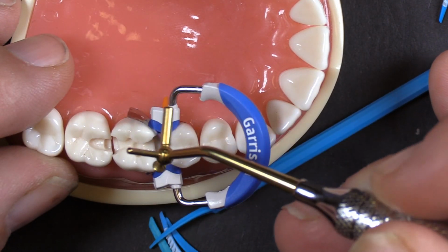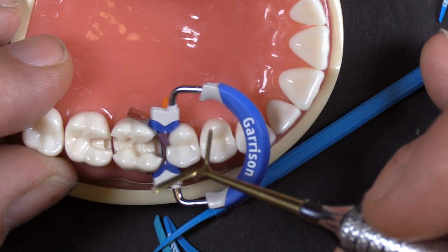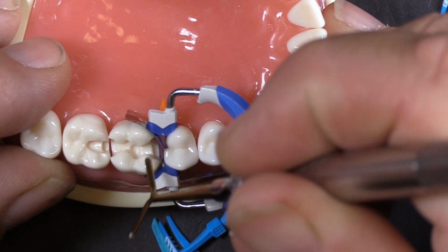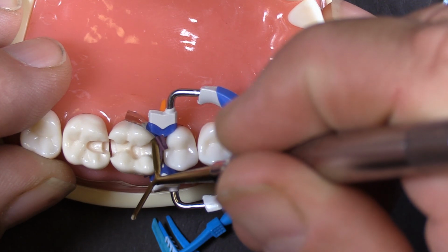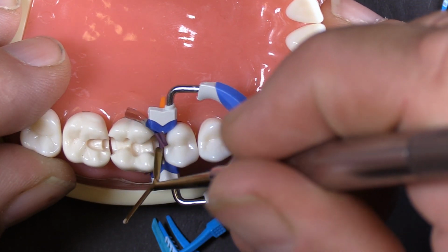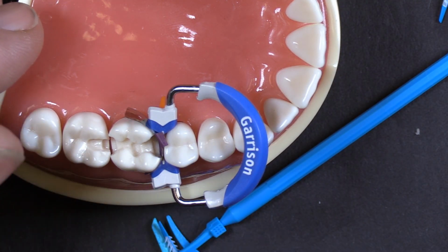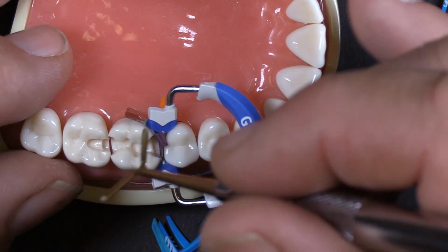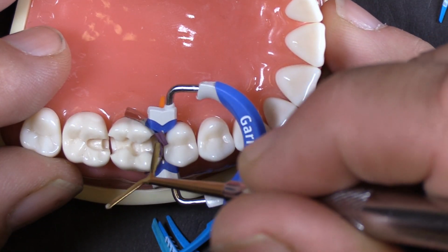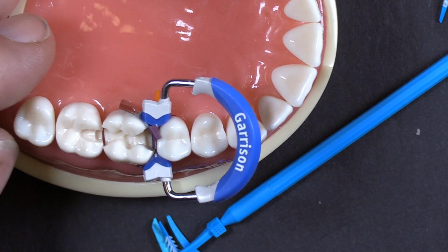and maybe you've come in with like an acorn carver and you've shaped the occlusion. It's a pretty simple thing before you've cured that last layer to come in with an instrument and just reach under the edge of that band and roll that marginal ridge over. I think you'll have a better result than trying to carve that in with rotary instruments after the fact. But just again, a little thin blade, come in there, roll that soft composite over a little bit, and then cure it.